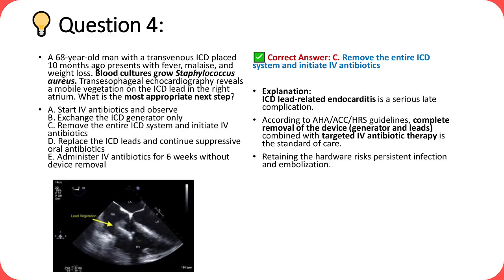According to AHA, ACC, and HRS guidelines, the most appropriate next step is complete removal of the ICD system, generator, and leads, followed by intravenous antibiotic therapy. Simply treating with antibiotics without hardware removal risks persistent infection, embolization, and treatment failure.